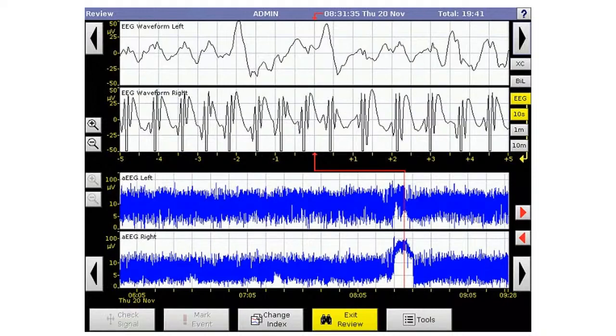So this particular monitor screenshot is 10 seconds, each line up here representing one half of a second. So this is 5 seconds up to here, an additional 5 seconds. Depending on your screen length or the way you've set it, you may have 10 seconds or 15 seconds. But by definition, a seizure requires a rhythmic pattern that lasts for more than 10 seconds.